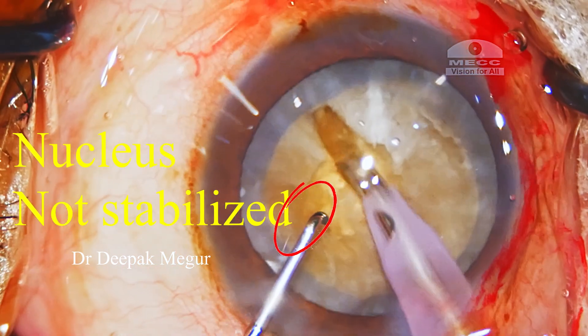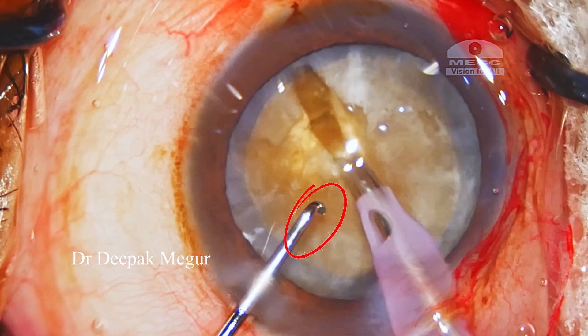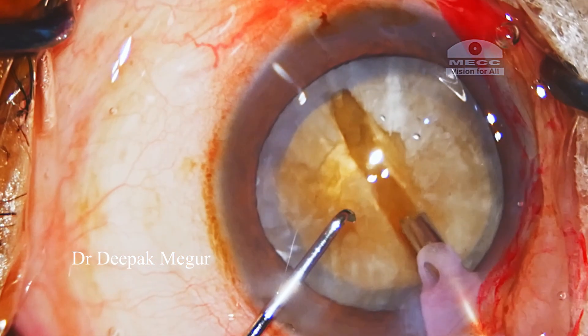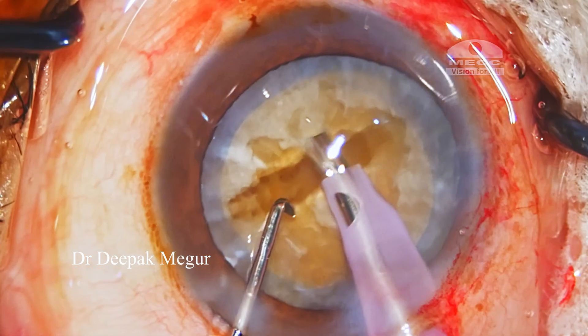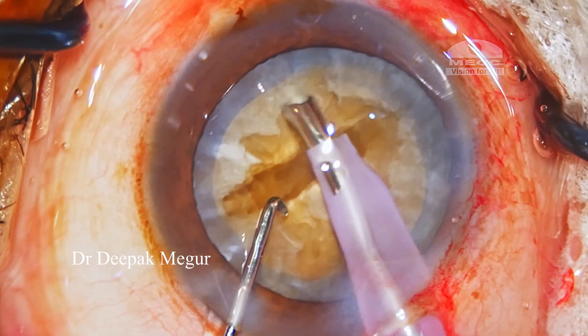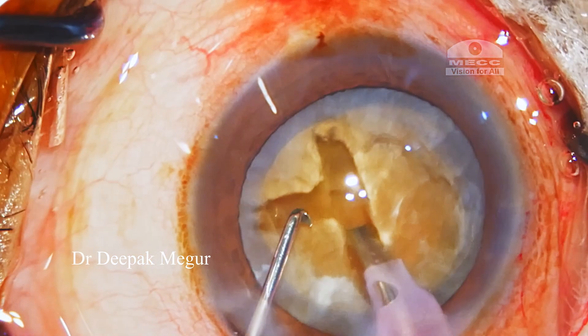The second obvious error is that the second instrument is not stabilizing the nucleus — it is just being held idle. Stabilizing the nucleus with the second instrument could have made things significantly easier, especially for a dense cataract like this.